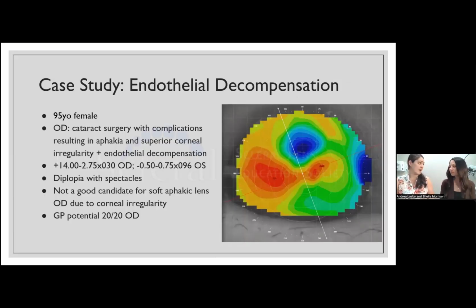So I'm going to pass it back over to you, and Dr. Morrison's going to take us through a couple more cases as far as just what to look for, both in normal fits, but also if you are doing more impression-based and digital freeform designs. This is kind of fun as we merge and go from the old-fashioned pouring a real old-fashioned on that slide.